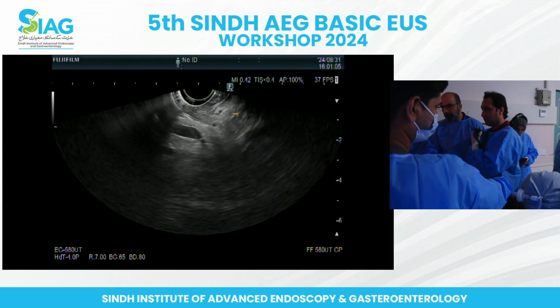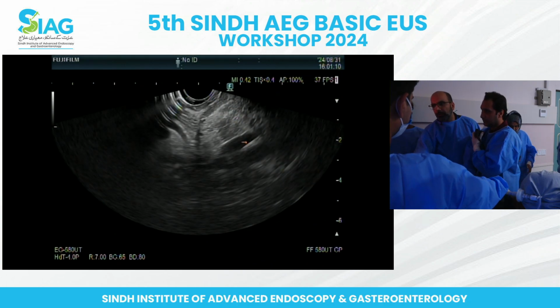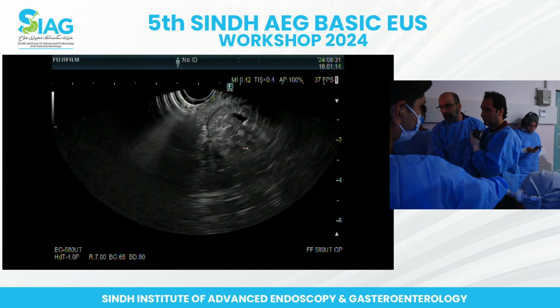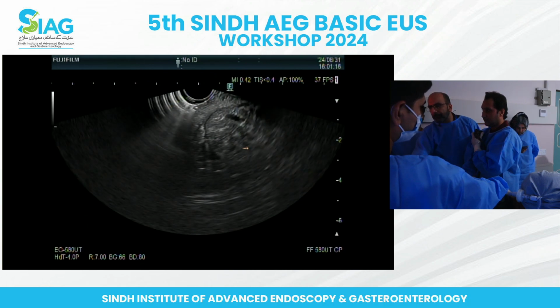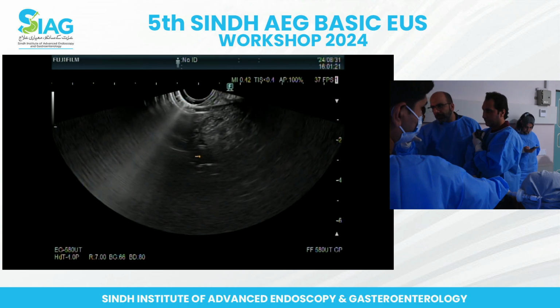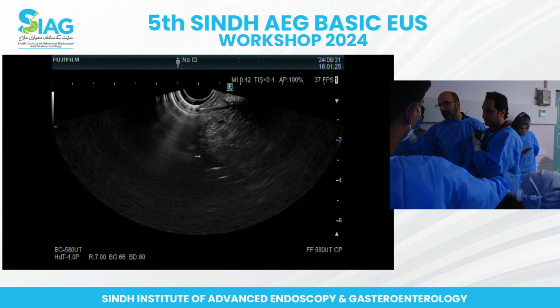And now pull back the scope a bit more. You can tell from your vessels if you've made progress or not, right? If you've pulled enough or not really. So pull back, keep pulling back a bit more. Bring the PD down to 6 o'clock. Good, keep pulling back, relax your big wheel a bit. So keep pulling back and spin around.